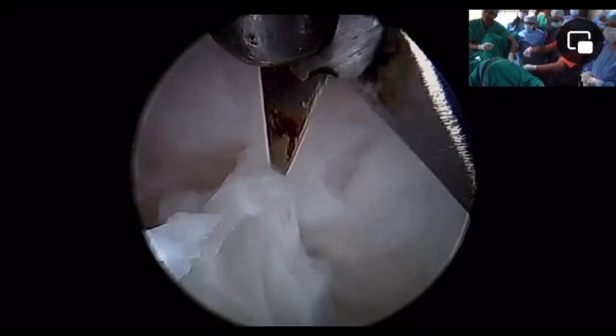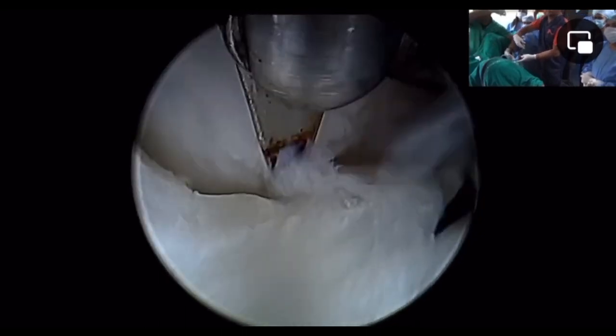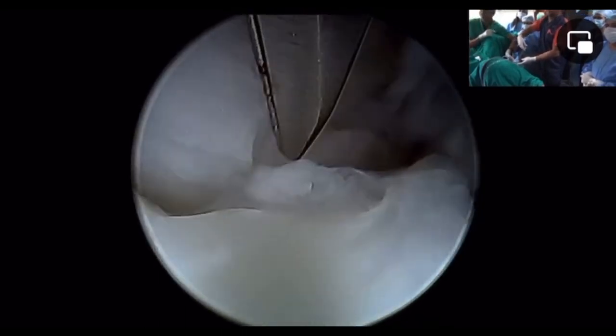This is the capsule of the myoma. Actually, here is a little bit terrifying. You are working between the myoma and the myometrium, pushing the capsule with the scissors and using the jet of fluid pressure to help you in dissection, push, retract, and reach all around the myoma and free it from its attachment.